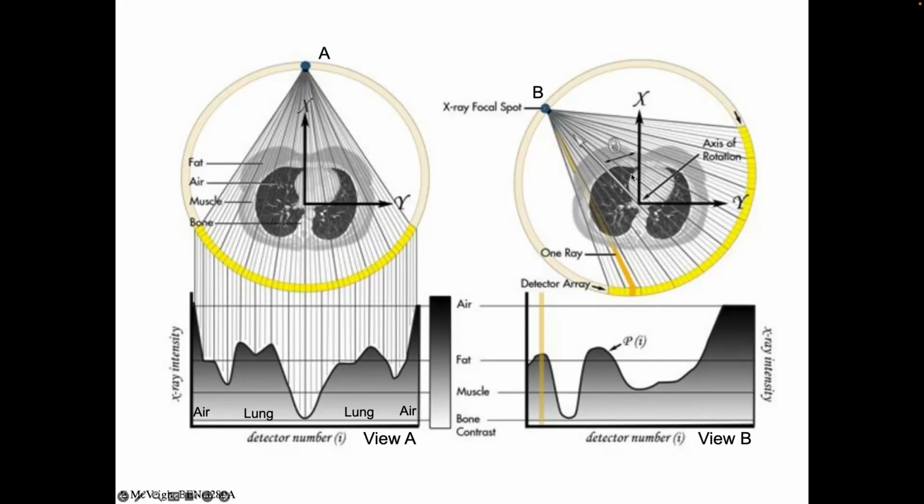Now I click the gantry along in a controlled fashion, and I measure a new shadow at a different angle. And still, I know exactly which detector I'm measuring. I know what angle the gantry is, so I can draw this pathway back through the imaging volume. So I know that the sum of attenuations through that pathway produces an X-ray measurement of this amplitude, right? And so this shadow just changes dynamically as I rotate my gantry around. I just keep the X-rays on the whole time, and then I'll just sample out what the signal is, maybe 8,000 times for a 360-degree rotation. Right?